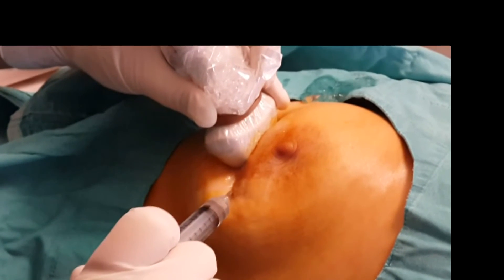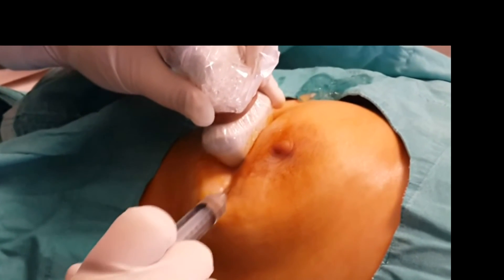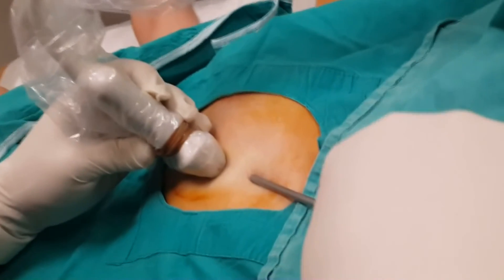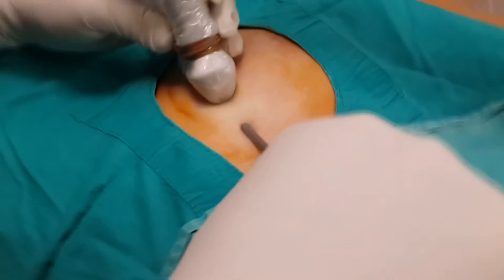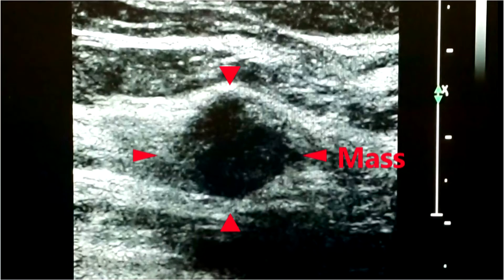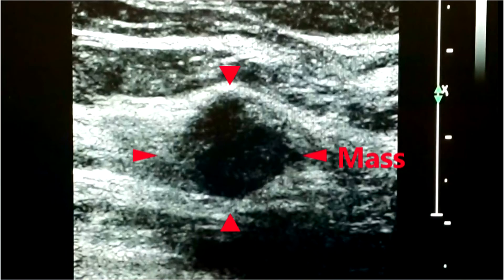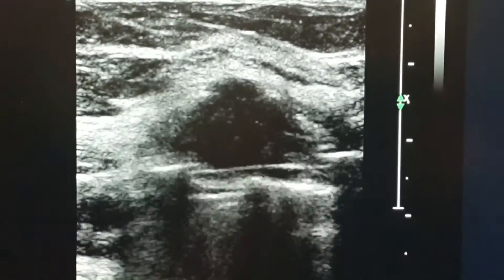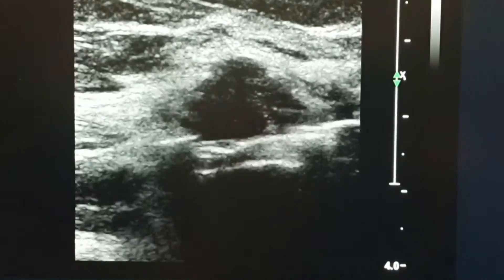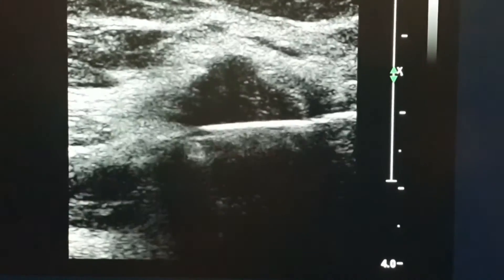For vacuum biopsy, we first numb the skin and the region around the mass with local anesthetic injection. After this, the patient will not feel any pain. After local anesthesia, we make a small incision at the skin and through this incision, we insert the vacuum biopsy needle towards the mass. The sucking, cutting and removing of the tissue by the vacuum biopsy system can be seen on ultrasound during the whole procedure.